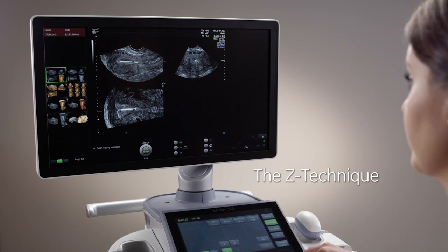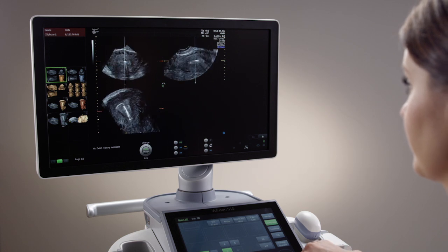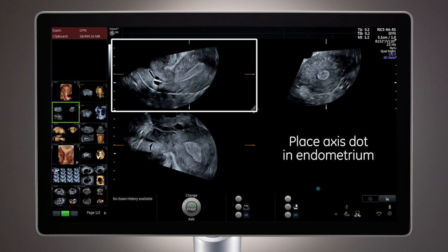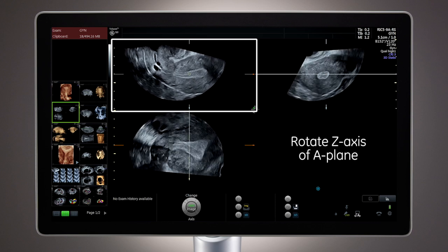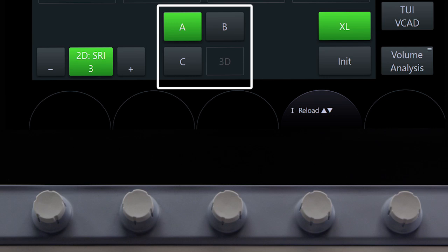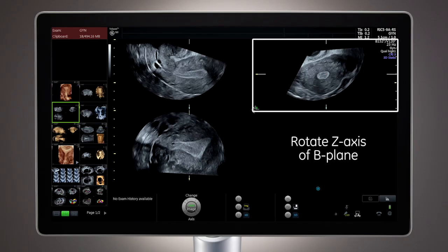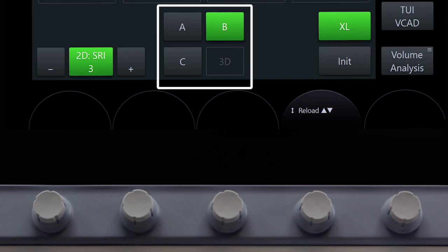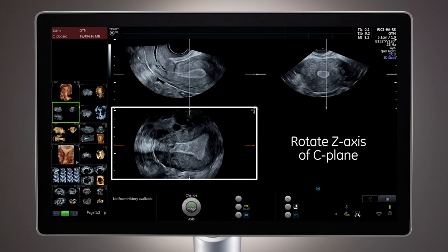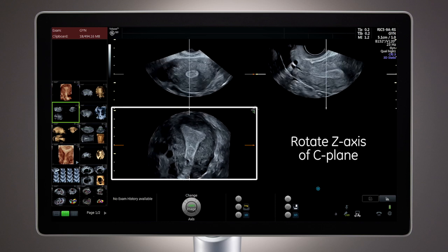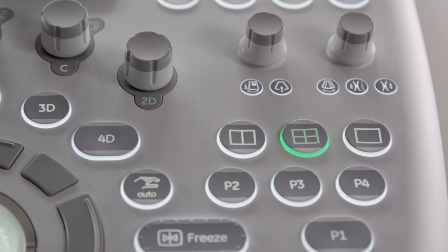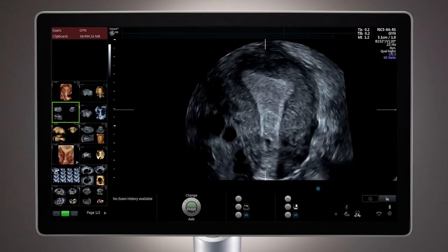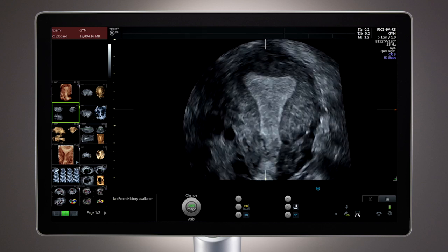An easy way to evaluate the uterus is to use the Z-technique, meaning the only axis you rotate is Z. First, place the axis dot at the level of the endometrium in the A-plane, then rotate the A-plane on the Z-axis until the endometrium is horizontal. Activate the B-plane on the touch panel, then rotate the B-plane on the Z-axis until the endometrium in the transverse plane is also horizontal. Activate the C-plane on the touch panel and rotate on the Z-axis until the fundus is upright in the 12 o'clock position. The C-plane can also be displayed as a single screen and parallel shifted through. This plane of the uterus is unique in ultrasound 3D imaging, as it is not a plane accessible in 2D imaging.